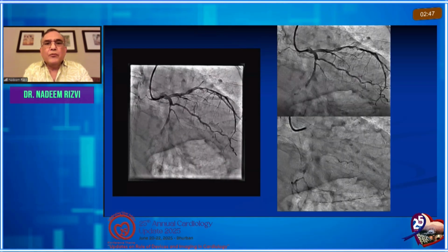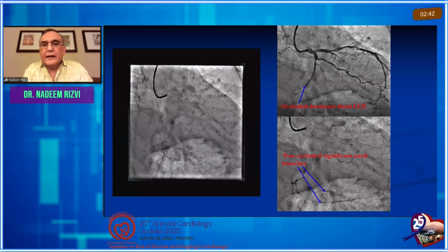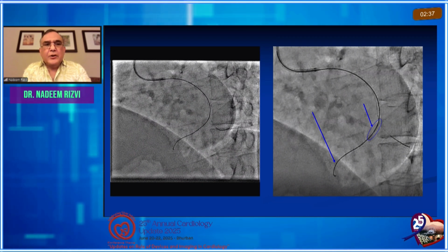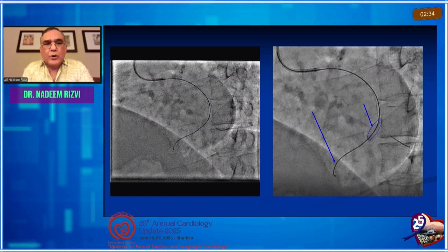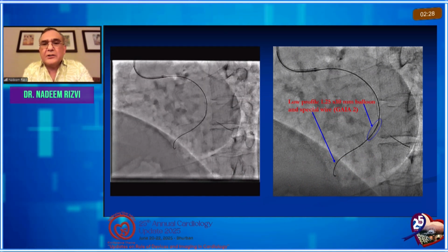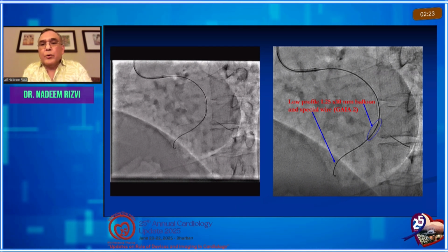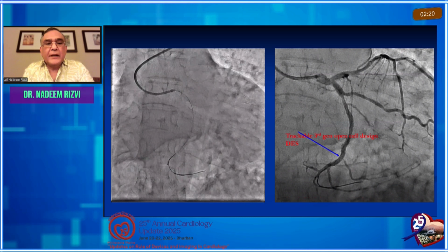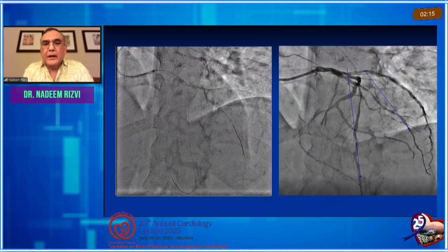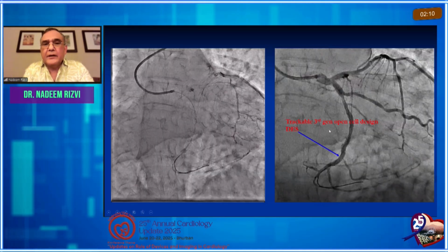So basically, you've got an occluded dominant distal left circumflex, and the late filling shows that the post-occluded vessels are of significant size. So for the inventory, the simple wires wouldn't cross, so you needed special wires, and then a balloon would not cross that distal occlusion, so you needed a 1.25 by 10 millimeter balloon and good support of the guider. So that's important. Finally, you need to stent that distal bifurcation in the OM, and you needed a trackable third generation open cell design DES.